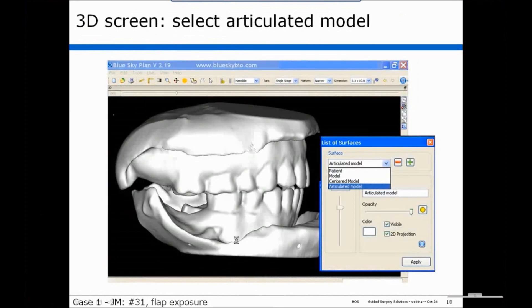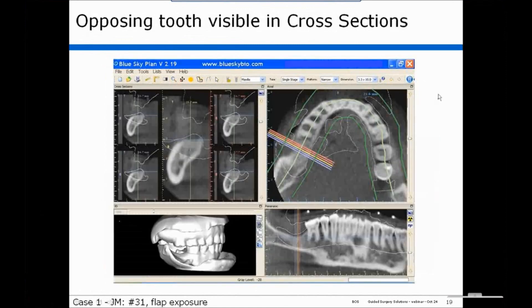The first thing we recommend in this case is to go to the 3D screen and select the articulated model. What this does for you is it provides the outline of the opposing tooth in your cross-sectional view, as you can see right here.